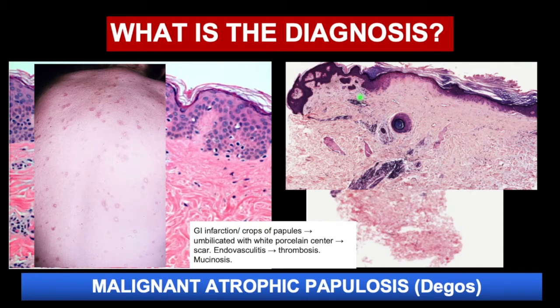At the end stage you will see the fibrosis that mainly affects the superficial dermis, and if the lesion is chronic enough, you will see that all the dermis is affected. Another thing you will notice in those lesions is the mucinosis, especially from low power, that could be a sign that helps you with the diagnosis, but it is a very rare condition. However, it is very important to know about those vascular patterns, because they are very important on the test.